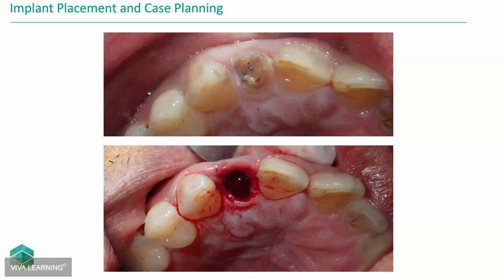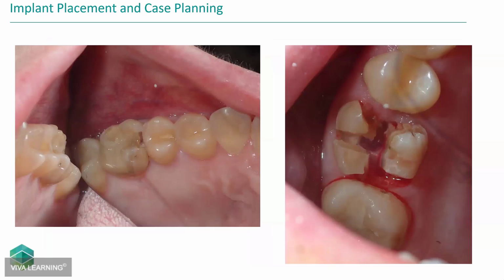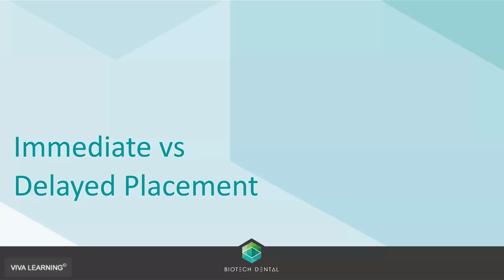So like this case, take the tooth out. It almost looks like the tooth just disappeared. Section the tooth. Don't rock it back and forth and expand that socket like I was taught. Multi-rooted teeth, section them into their multiple roots, take those out. This is a case where we took the roots out, prepared it, put an implant in, got it right in with very minimal damage.